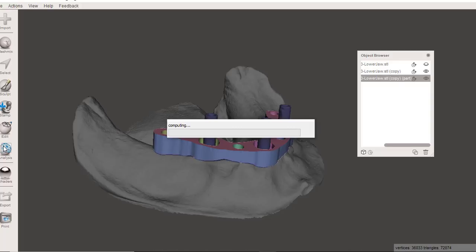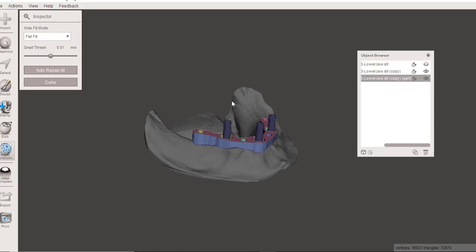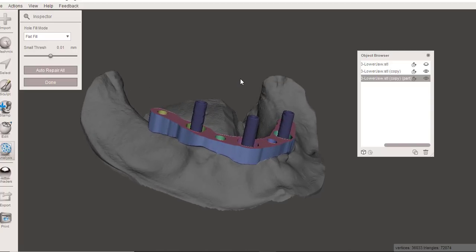And one thing I should have done prior to exporting it is run an analysis and an inspector. And if this threw up any holes, I would need to fix those and then export it again to export the repaired one. So now what I'm going to do is I'm going to print this object.